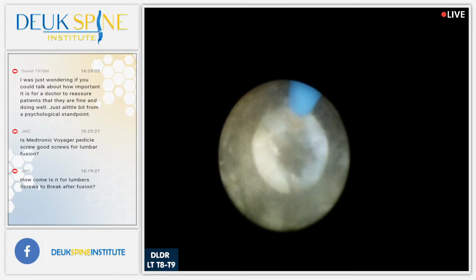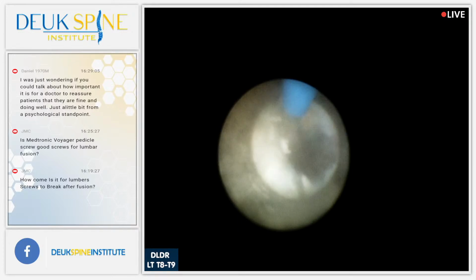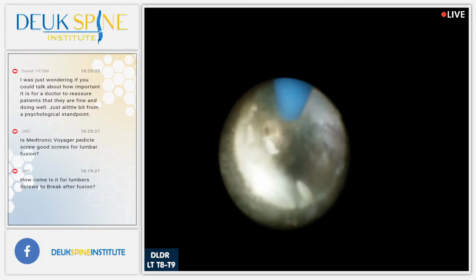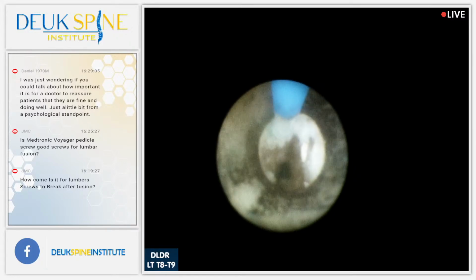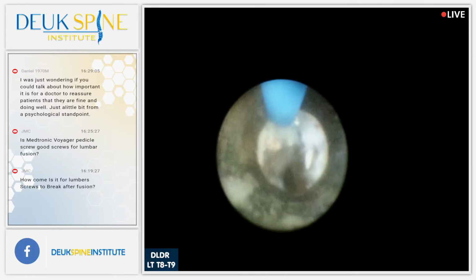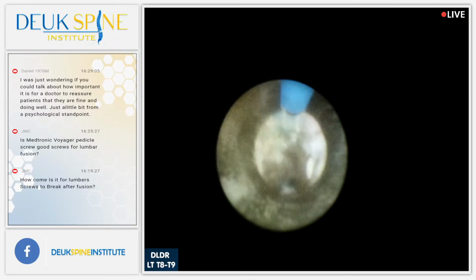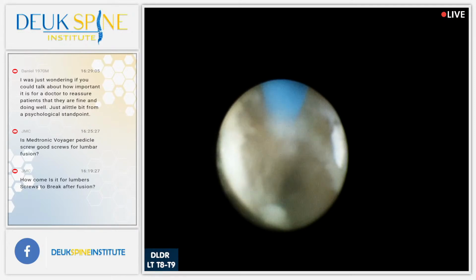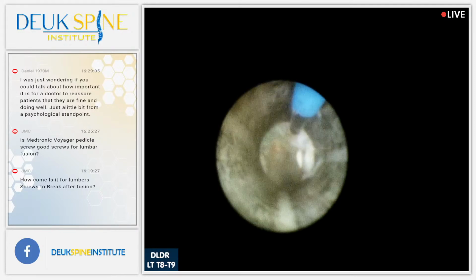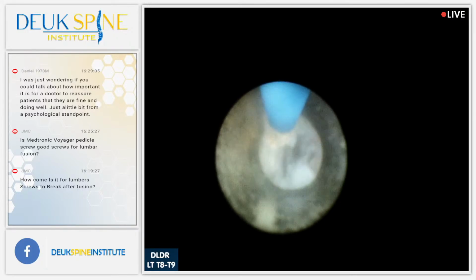Well, it's interesting here because I thought I would be done quicker, but just about. Literally 30 seconds, I think we'll be done. This has got to be it right here. I must have been in the disc deeper than I thought, just because he must have been twisted a little bit. There's a little bit of calcium here. That's what we're seeing. And I'm just trying to clean it all up for him. Just about out. Really right on the cusp of being outside the disc right here.